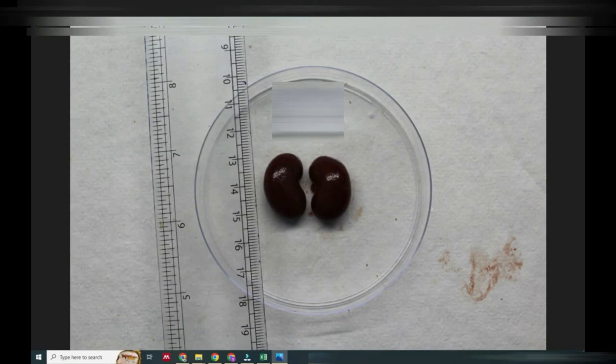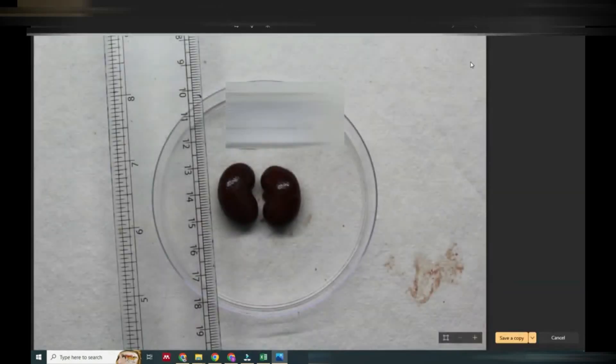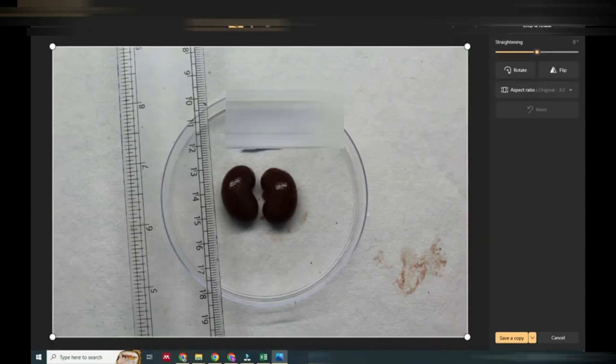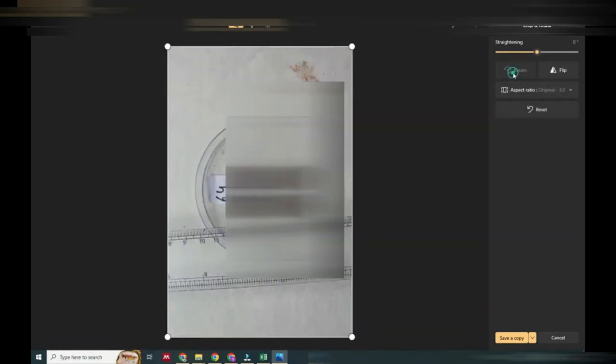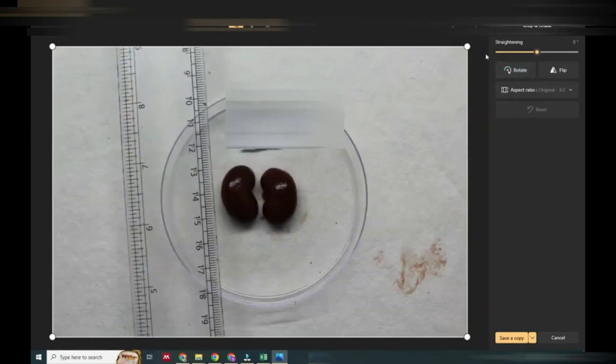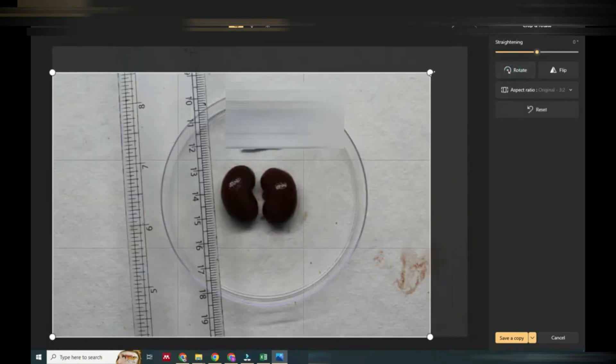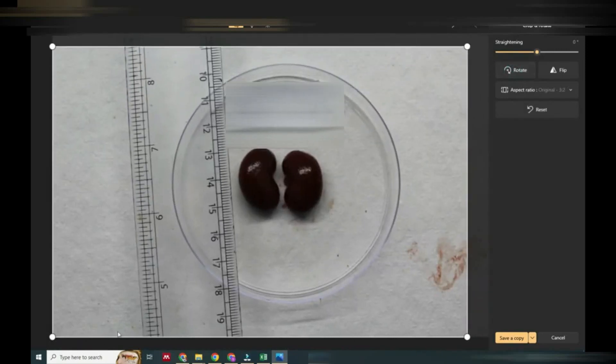Now we have to make this image bigger so that we can easily analyze it. We will use all the options in photo editing tools.